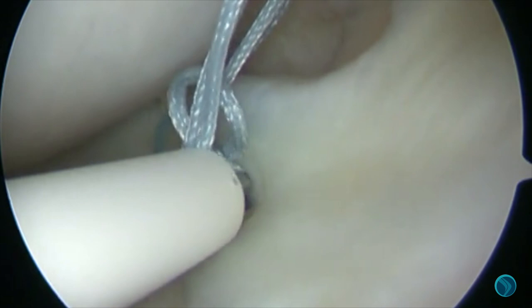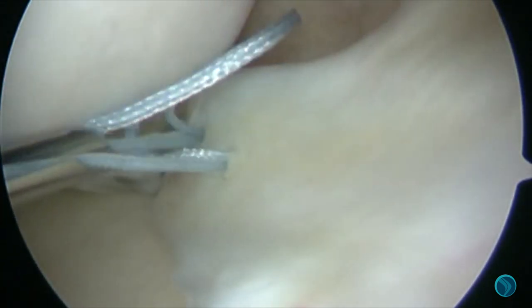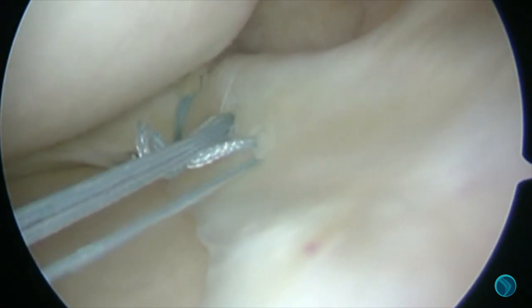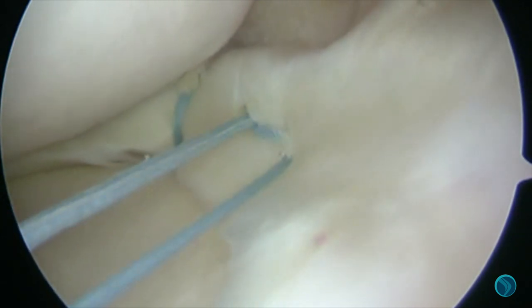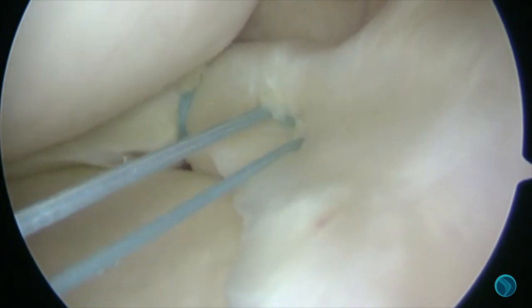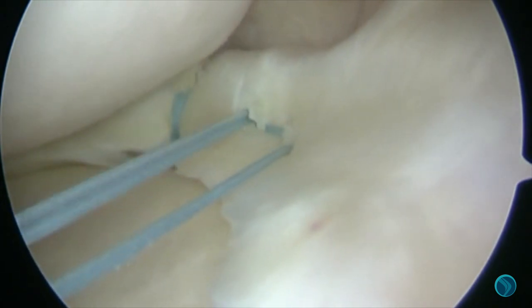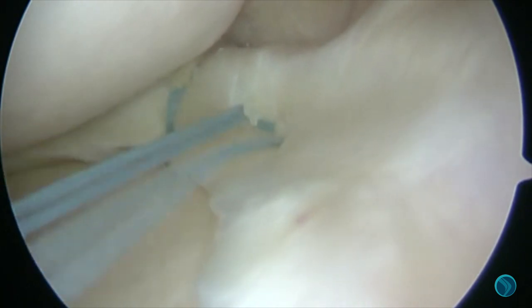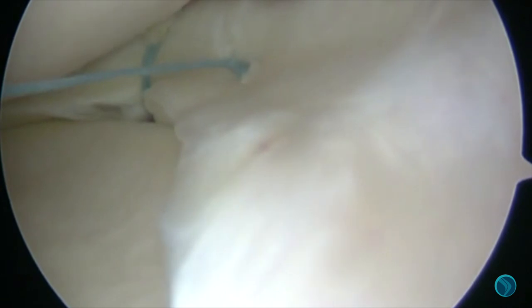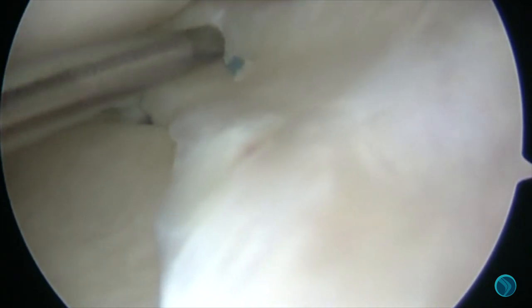Bring it back into the knee, then pulling on the loop just to snug that suture down. You can see it really pulling the meniscus into the capsular rim. Pull the spare length, closing things down, and then using the cutter just to trim that completely.